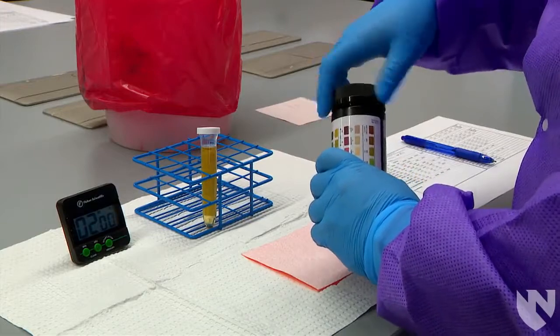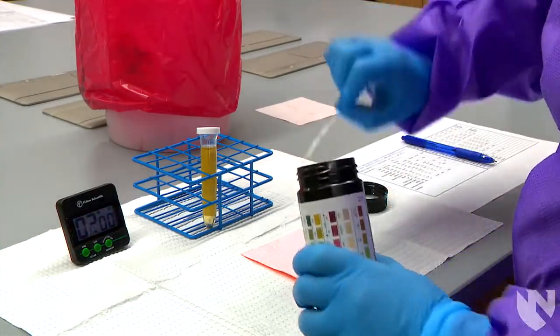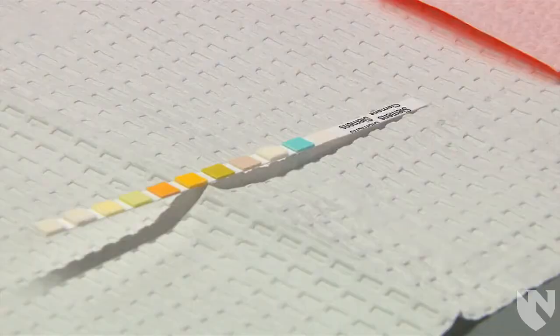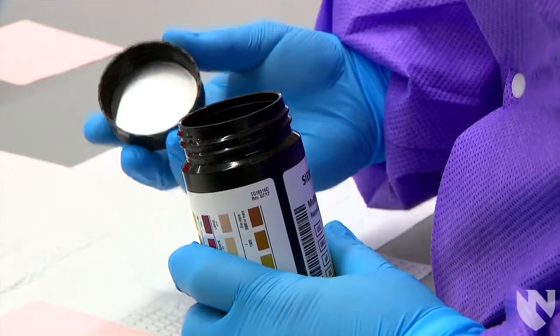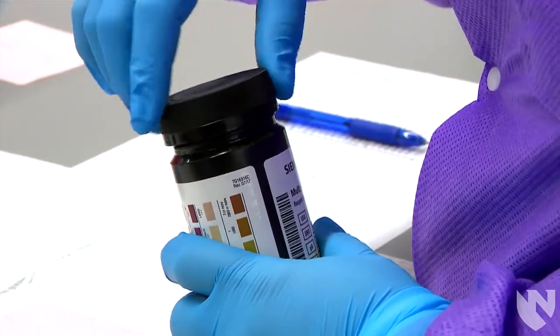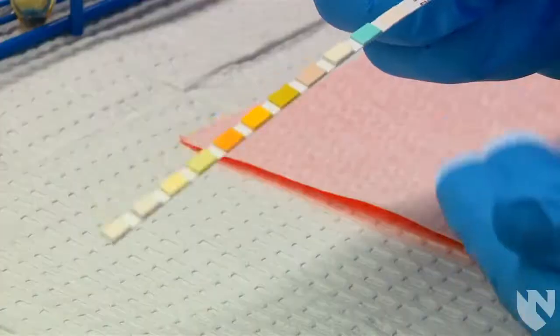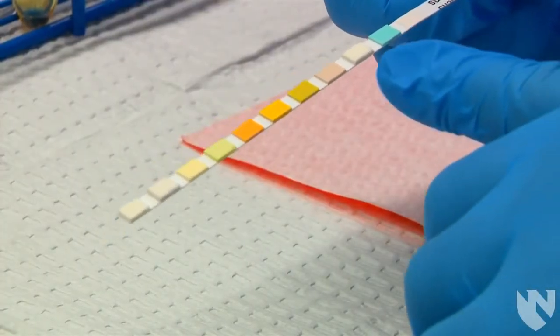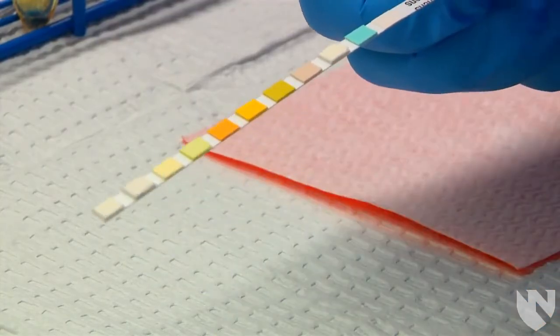Remove one strip, making sure not to touch any of the reagent pads with your hands, and place the strip on top of the white mat on the counter with the reaction pads facing up. Replace the lid on the reagent canister immediately to ensure the remaining strips in the canister remain protected. Inspect your strip to ensure there is no discoloration on any of the reagent pads on the strip.